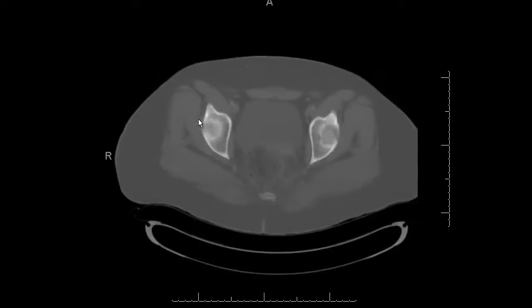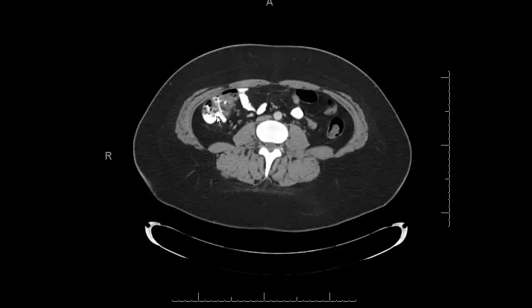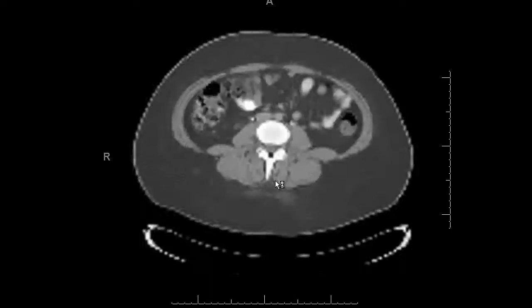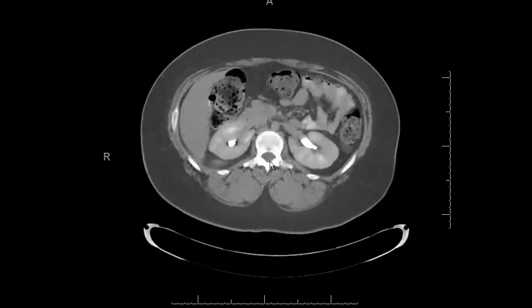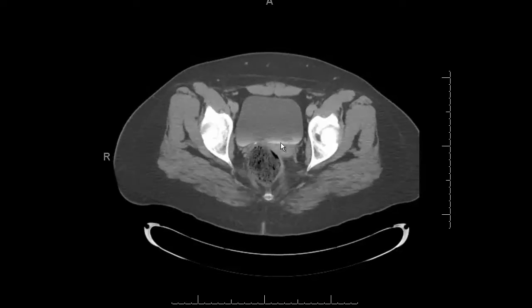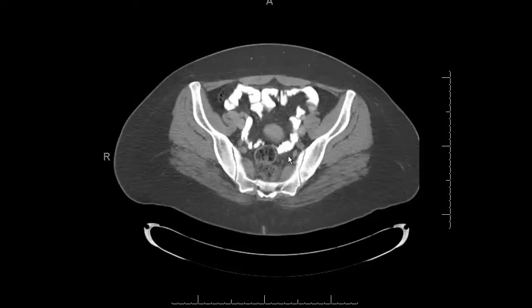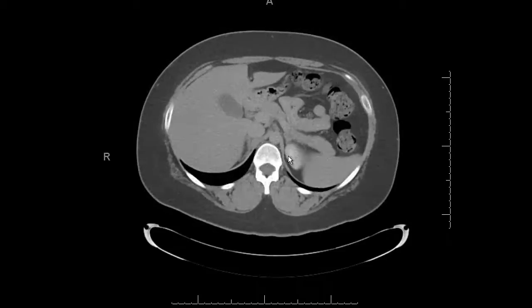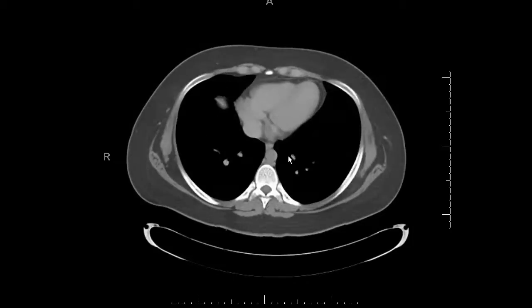Then I look through the muscles and bones. Go to bone windows, look through the bones, then in soft tissue windows look through the soft tissues and the spinal canal. Then pull up the delayed images — for those I particularly focus on the kidneys, ureters, and urinary bladder, making sure there's contrast within the bladder. It's often helpful to also look at the other solid organs and bowel on the delays. I usually scroll through the delays a bit quicker since I've already looked at everything once.